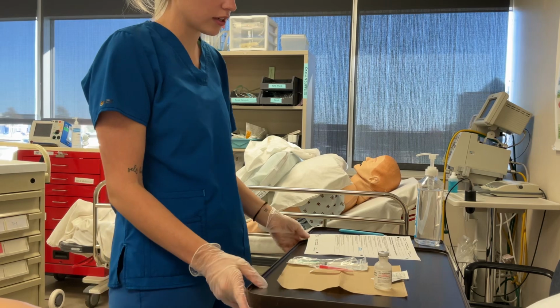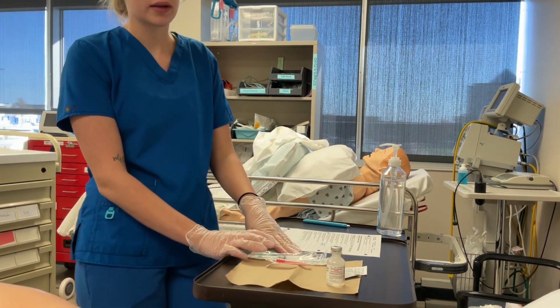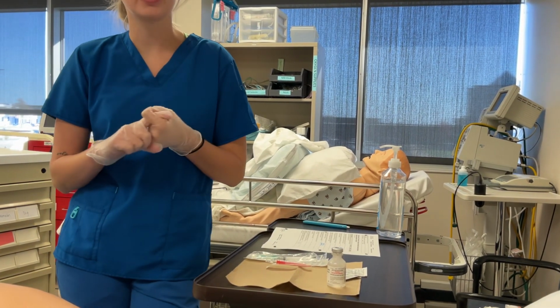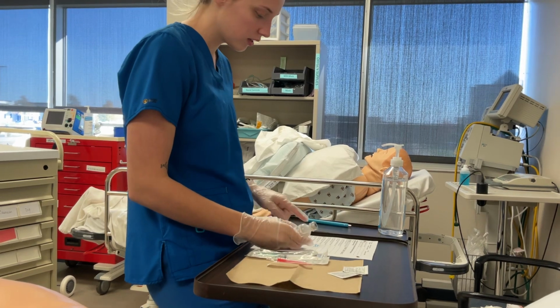And then I'm gonna do the third check at bedside. I'm gonna open all my stuff in front of the patient. The patient has the right to refuse and has the right to know what they're being given. So now the third med check.